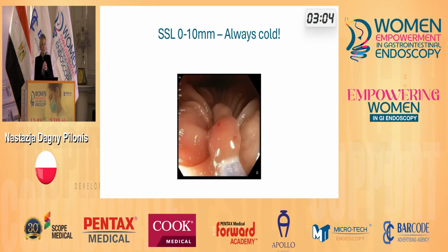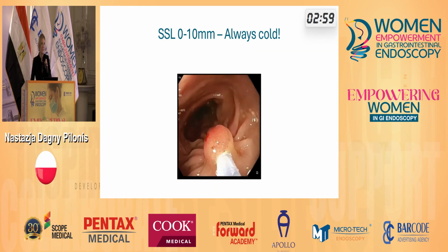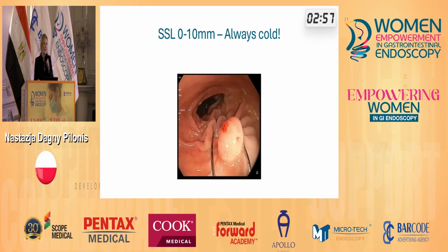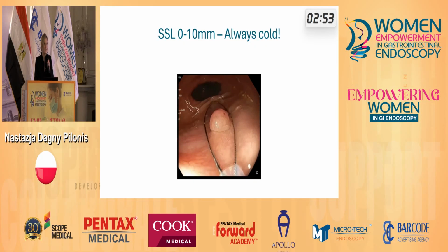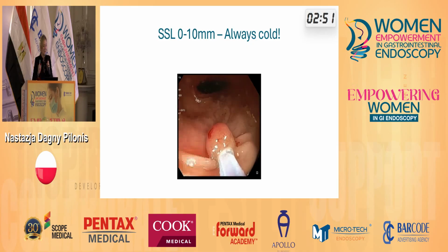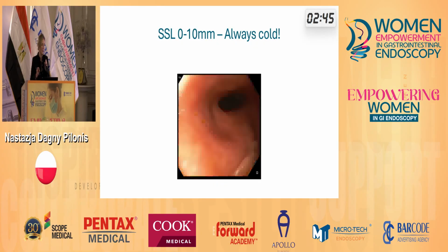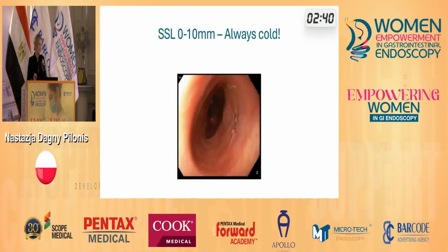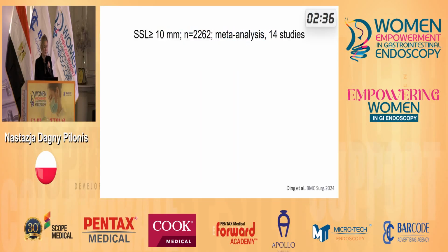In cold snare polypectomy, sometimes we have to work on this a bit more, and sometimes we even have to pull the snare into the scope to achieve this cold resection. And what is more, the effect after the resection is not always as elegant and beautiful as after hot snare polypectomy. But don't get discouraged. This is the best way to go with those small polyps.